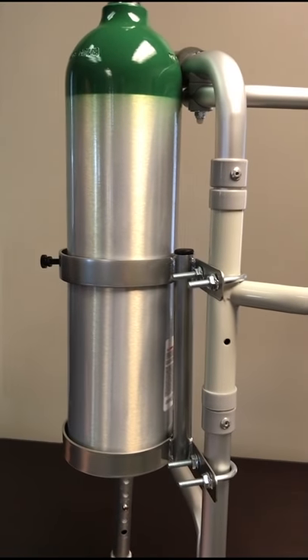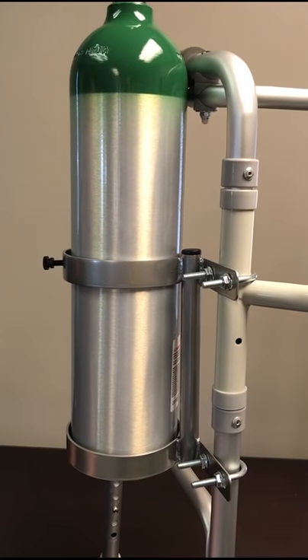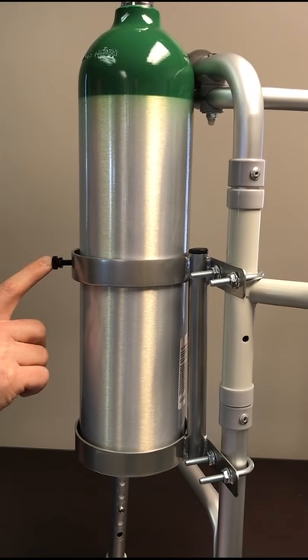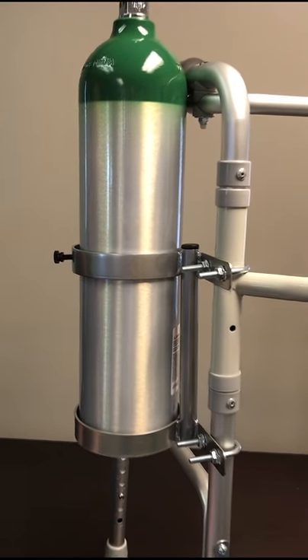It comes with everything that you'll need to quickly and easily attach to your walker. This also features a nylon securing bolt for your oxygen cylinder, and we powder coat these chrome for a durable finish.